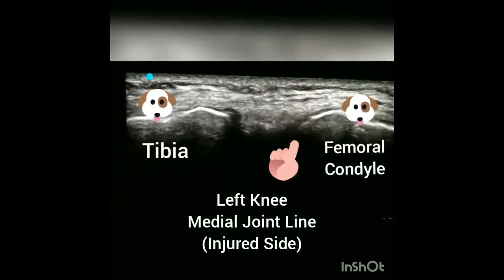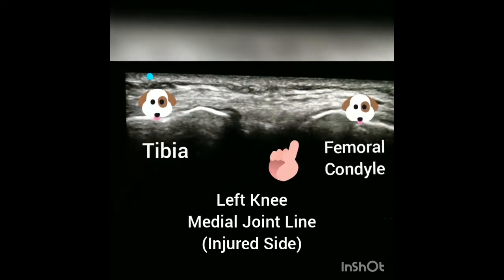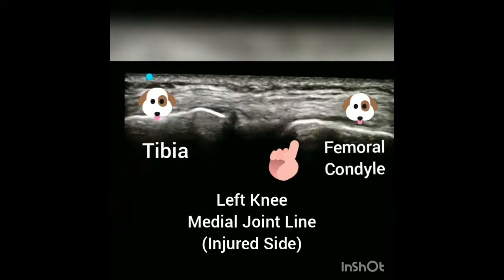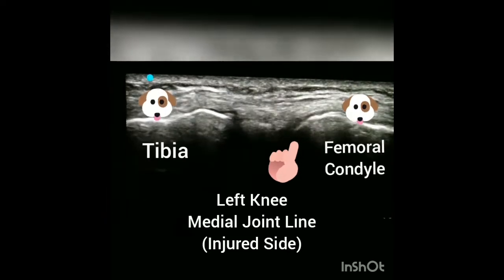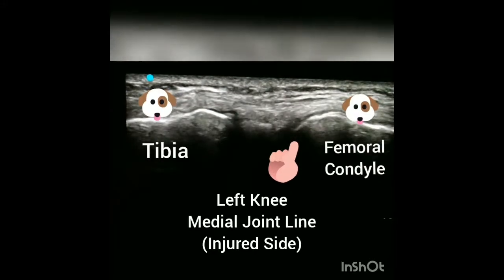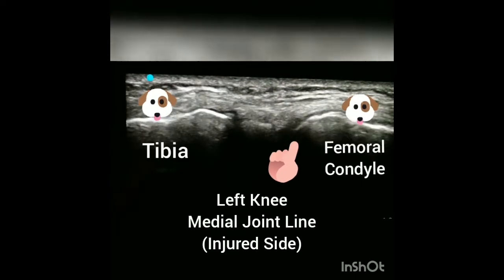Now when you compare that to the injured left knee, as I'm applying valgus stress, you can see a fair amount of translation of the medial femoral condyle, which represents the laxity of the injured ligament. In addition, you can see gapping of the joint line as well, which contributes to the instability that is felt with this type of injury.